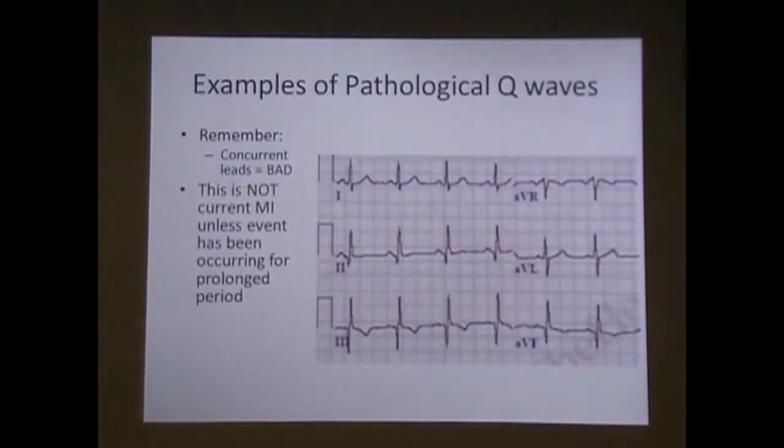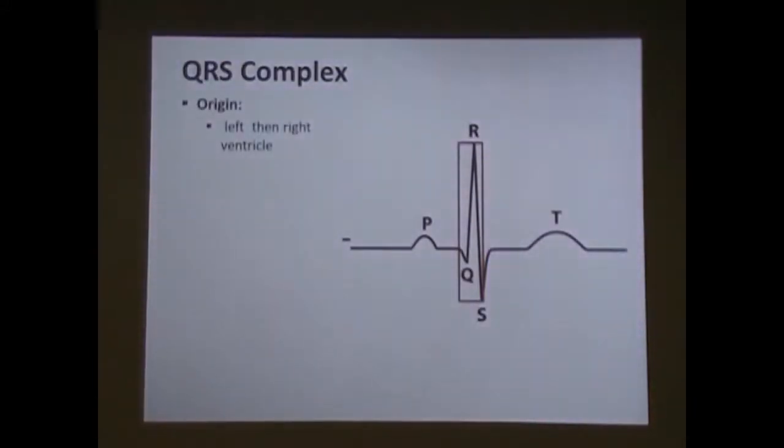And again, I just want to reiterate, this is not a current MI, this is a previous one, unless the patient's sitting there saying, I've had chest pain now for 3 days. And you're like, this indicates cardiac history.